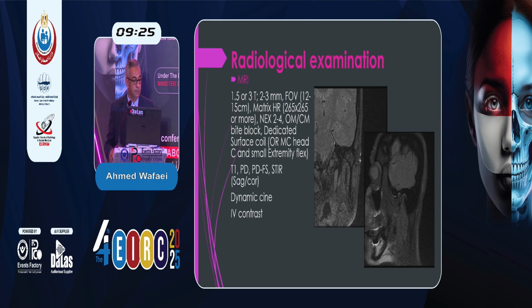Sequences are T1, proton density fat sat, and the STIR. This is the typical sequence in our institution. We can also do a dynamic scan for the joint when we do the examination in closed and different open mouth grades. And we use IV contrast in case of inflammation and infection.